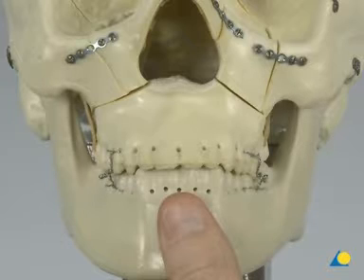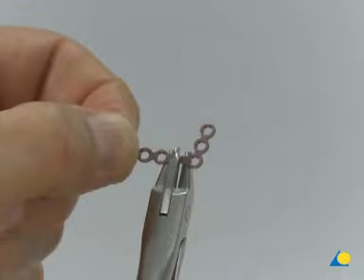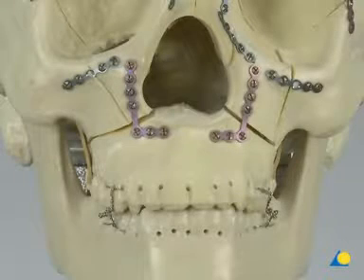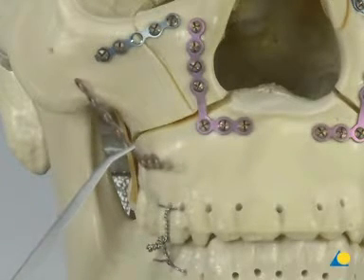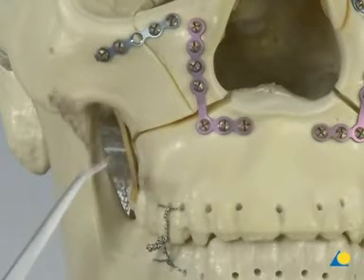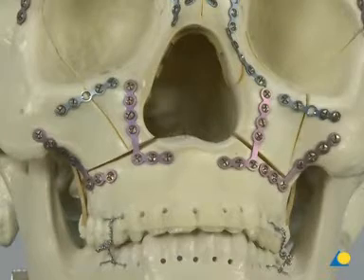The LeFort I fracture is stabilized with four 0.7 mm thick 3x4 hole L plates. The plates are contoured with the in-plane plate bender. The first plates are placed along the piriform aperture, restoring the nasal maxillary buttresses. The tooth roots must be avoided when placing the caudal screws. The fixation is finished with two more plates on the zygomatic-maxillary buttresses, where the bone is considerably stronger than over the maxillary sinus. All plates are applied and filled with screws.